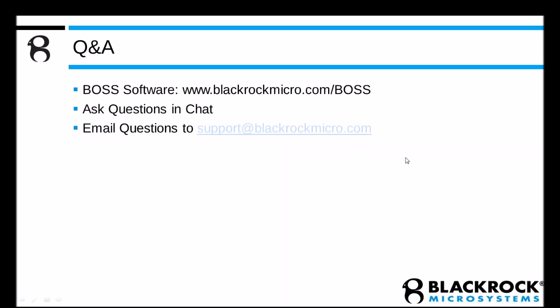There's another question that has come up: sorting a continuous data file from a session in which you're recording other experimental data. For those of you familiar with the BlackRock system, you end up with two primary data files, your continuous data and your neural event data, which includes things like experimental triggers, comments, and digital inputs.